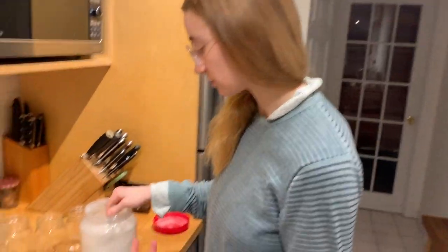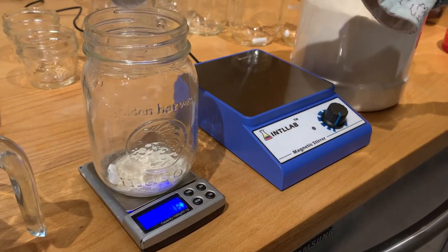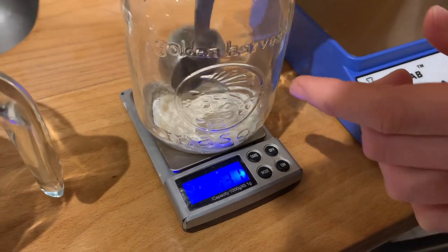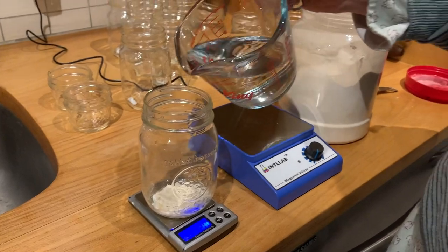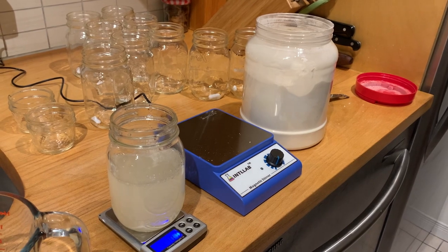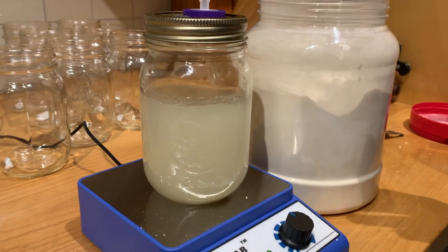We're just going to turn our scale on, tare it, and put in 12 grams. Perfect. Then add our 300 milliliters of water — putting the dry ingredient in before the liquid. Then put your lids on, and use your stir bar to mix it up a little bit. Do that with all of your jars and you're good.